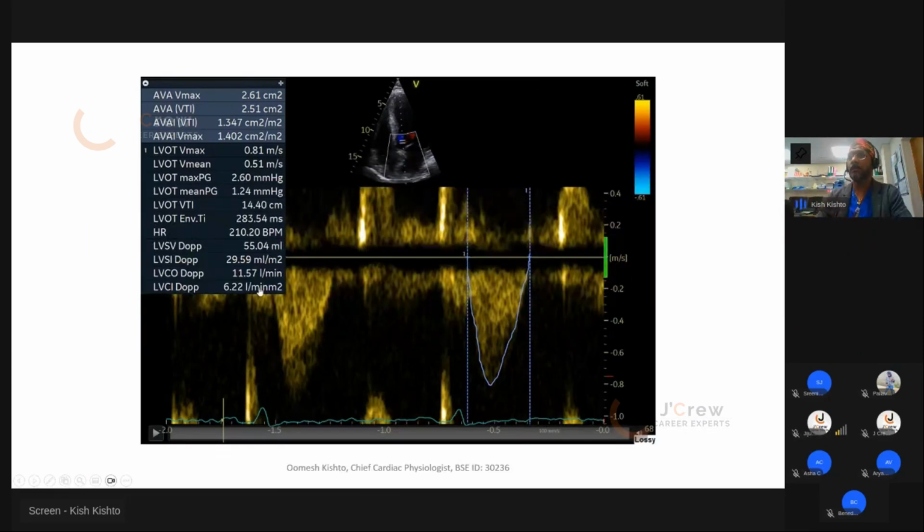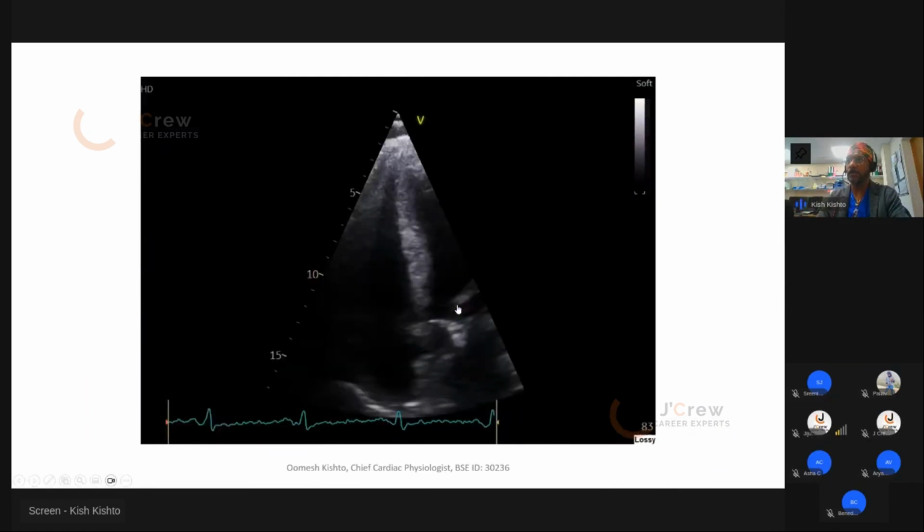So again here, I've already done the height and weight at the beginning, and measured the LVOT. Remember yesterday I mentioned about when you measure your LVOT trace. Now I have my LV stroke volume index as well, which is perfect. That does help tell us a bit more about your LV function. Okay, so this is a handy measurement for when you assess AS as well.